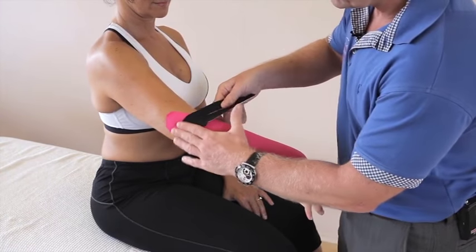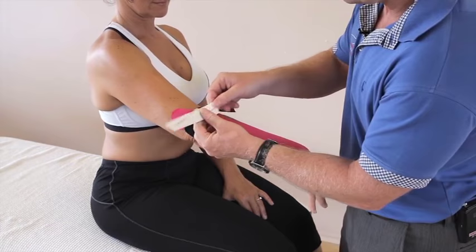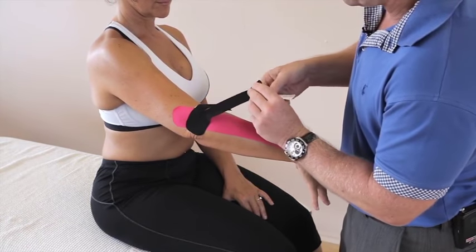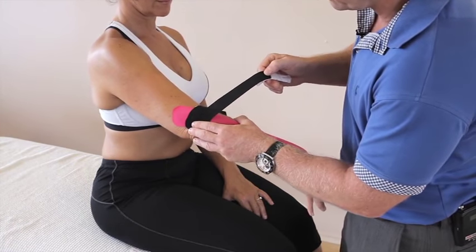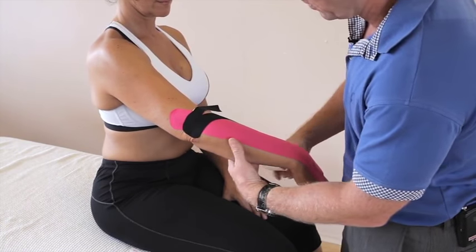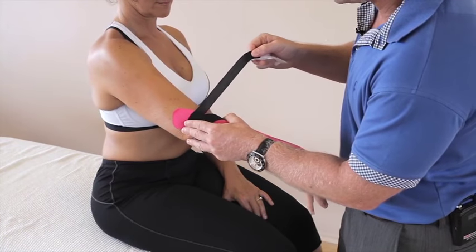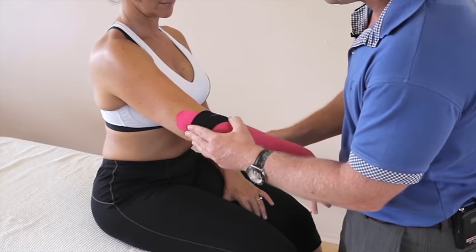From this position, with these two fingers, you're going to slowly pull in the tissue a little bit — 75% stretch. So 100% back up to 75%, feed that around the forearm. And the same on this one — pull that, use your finger with a little bit of tension, 75%, feed that around.